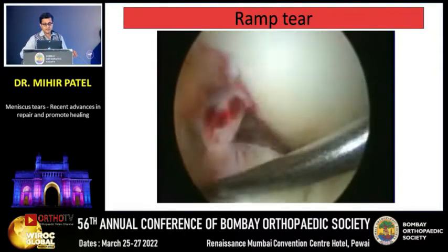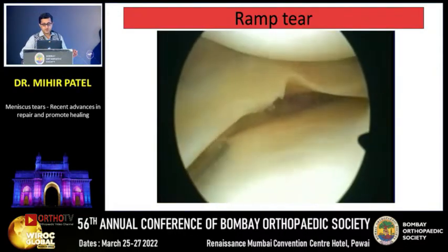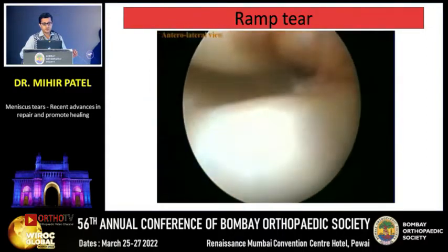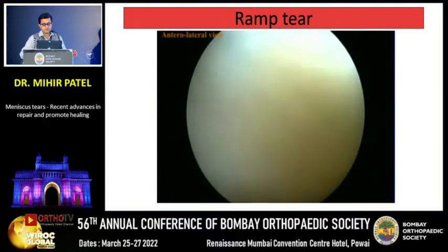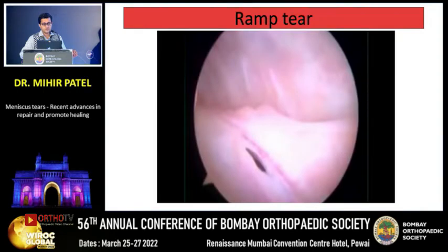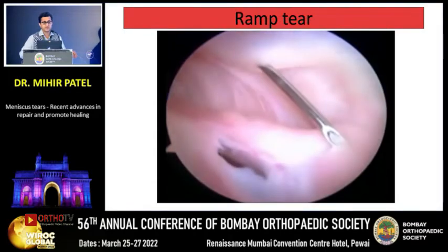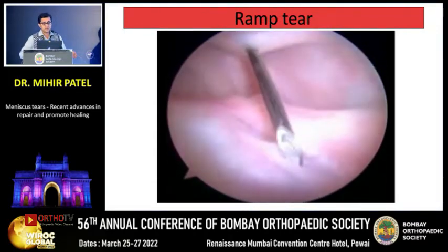This is a case of an ACL tear patient. The meniscus looks almost normal anteriorly, but you can see a little capsular avulsion. When I go into the posterior medial portal and pass a needle into the posterior medial compartment, you can see the little rent which separates the posterior-most aspect of the meniscus from the capsule. This is called the needle test — a needle introduced from the posterior medial compartment is used as a probe to identify the ramp tear.